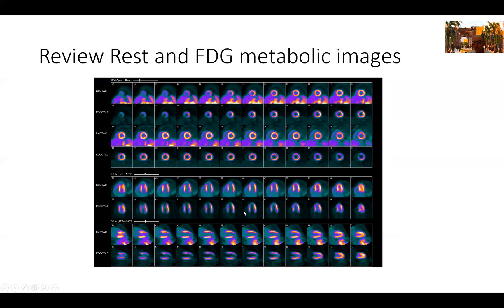Then the next step is to review the rest images with the FDG images. So now we're looking for matched versus mismatched defect. If we have a defect on the rest images that is matched with the FDG images, we have a defect on the FDG images, and that's the hallmark of what we call scar by PET. So we have here a defect in the rest images matched by a defect in the FDG images. No metabolic activity in that segment in the apex, absolutely none. And you can see here this is typical of scar.